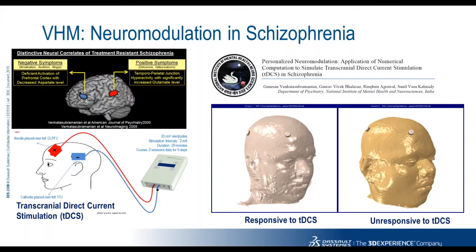Now, by controlling the polarity and magnitude of the applied current, it's possible to stimulate very specific regions of the neocortex to reduce the severity of the disorder. Since this is a low-cost solution that can be administered anywhere, and since unlike a drug, it offers highly localized stimulation, it is being actively researched by several mental health institutes across the world.